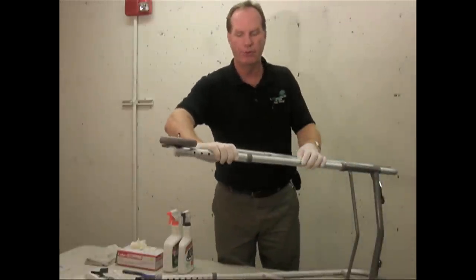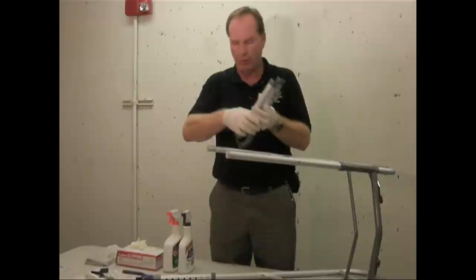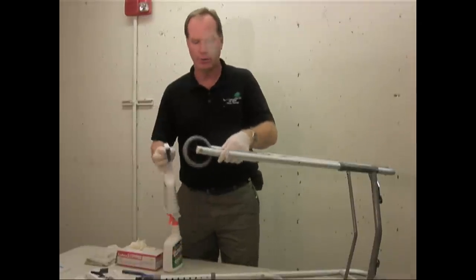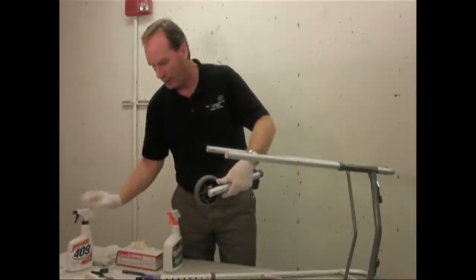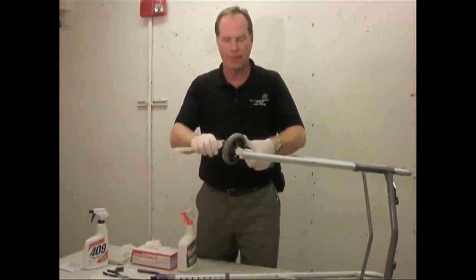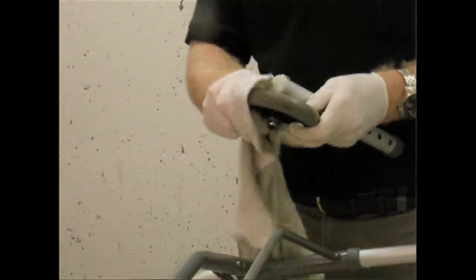The best thing to do is remove the walker attachments — the wheels — because the future user is going to adjust this and you don't want them to see any dirt that might have stayed behind. We're going to clean the wheels. Ordinary household cleaner works. Give it a good spray, use the stiff bristle brush, and make sure you get in the crevices. You can even submerge this in water — it does have moving parts, but water won't hurt it. Once we dry this off, we'll put it back together again.